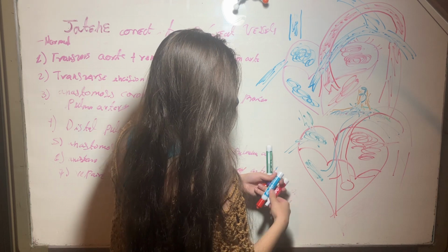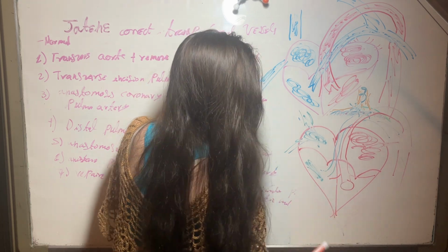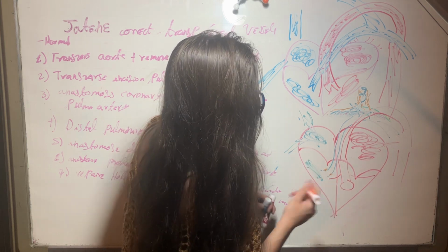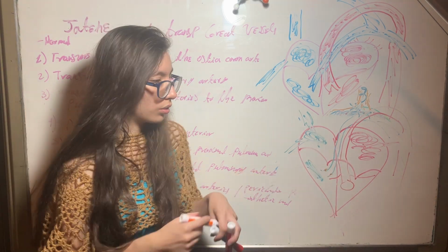And also here we have some patches of pericardium. And remember that we also need to correct the communication between the two circuits that we mentioned before.